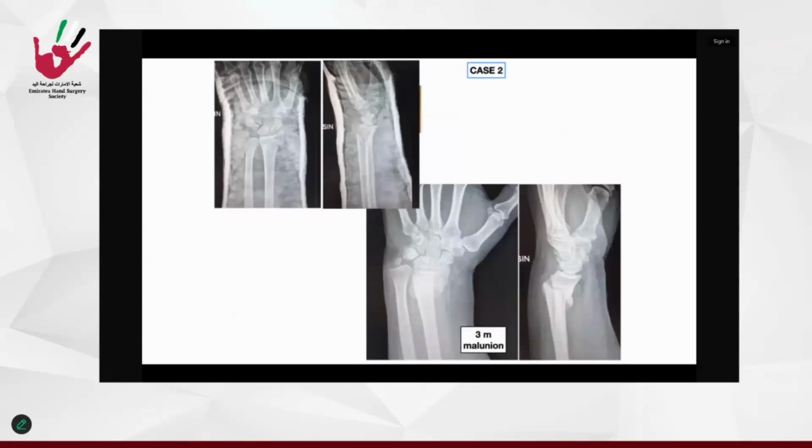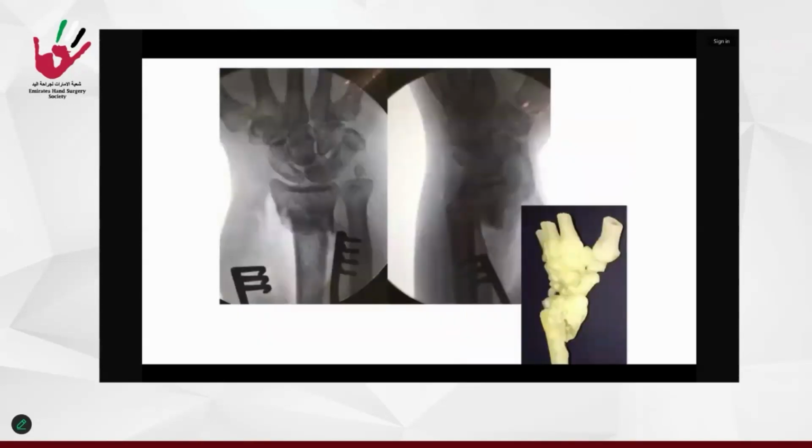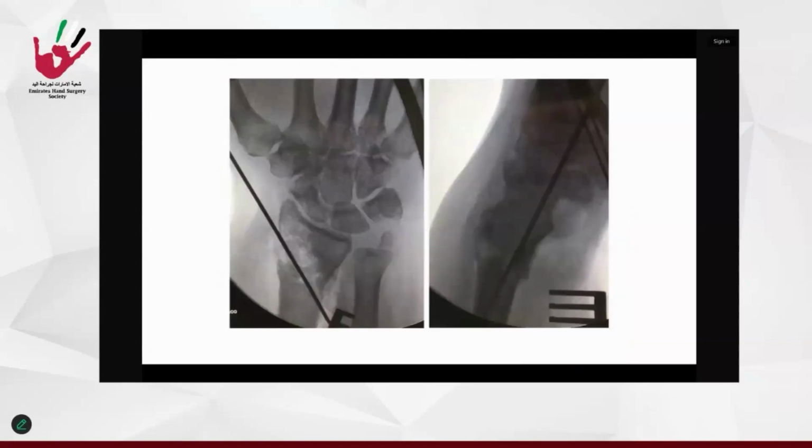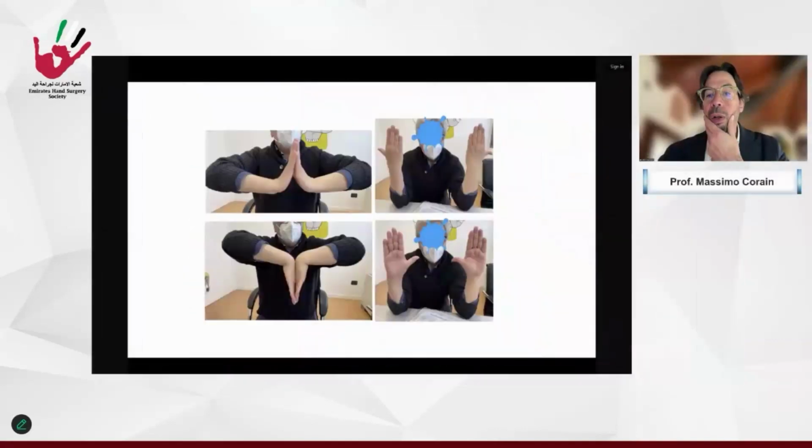This is an adult that had a fracture and 3 months malunion with this deformity, and with the 3D printing we can understand in a better way in order to recognize the original fracture line, in order to go in the surgery room to correct it, and to know that we can do that because the joint is not involved and because the distal part of the malunion is large enough to accept a normal volar plate, like this one, with a correction and a good functional result.